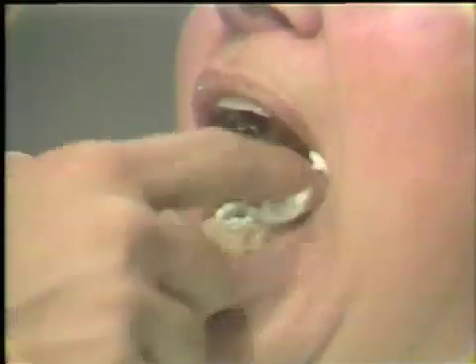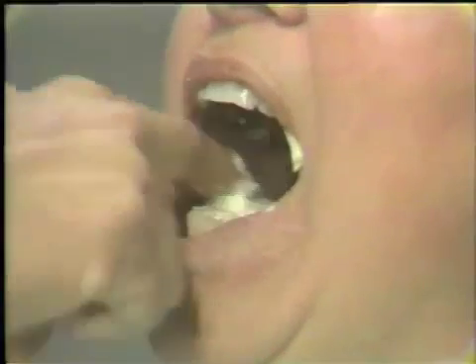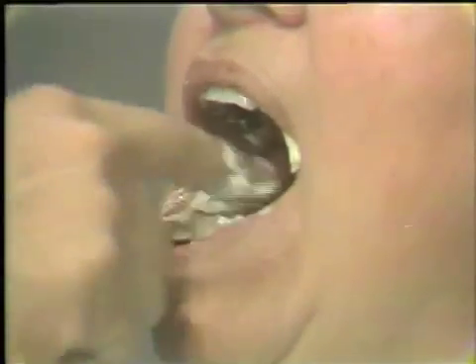You will get a predictable mix of alginate if the water temperature is kept at 68 to 70 degrees. The alginate should be mixed according to the proper specifications of water-powder ratio. Prior to insertion of the tray, the alginate should be applied to the areas of concern — mainly the abutment teeth and the lingual bar area, both on the buccal surface of the abutments and on the lingual and occlusal surfaces.